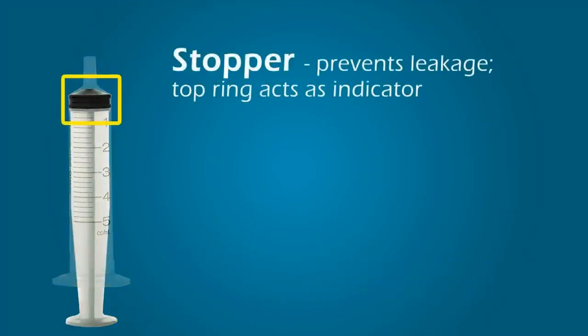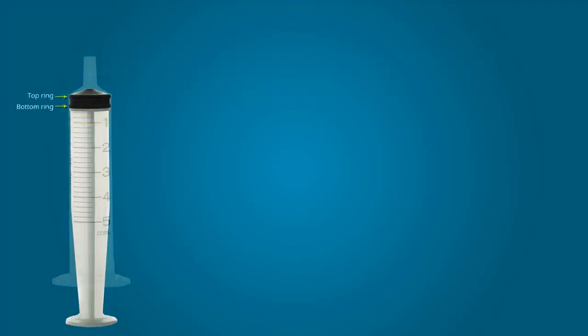At the top of the plunger is a rubbery tip called the stopper. The stopper prevents medication from leaking around the plunger. You will notice that the stopper has a top ring and a bottom ring. The top ring acts as an indicator for measuring the medication contained within the barrel of the syringe.